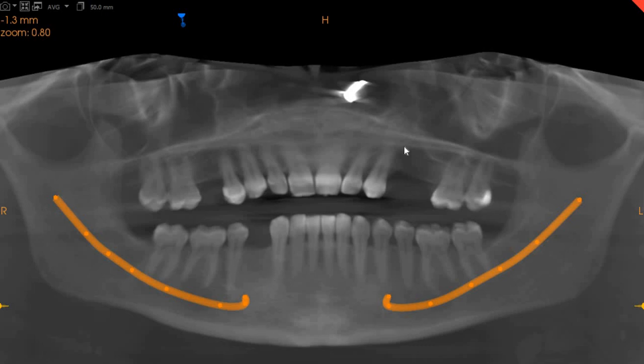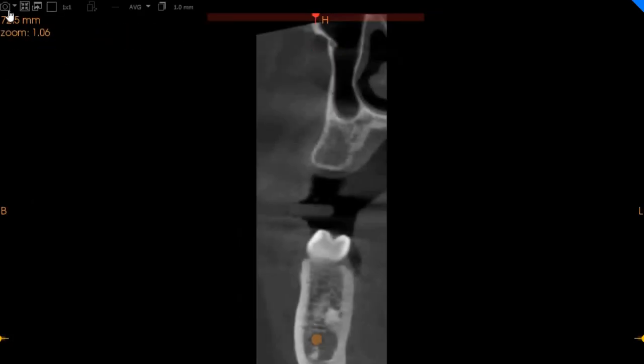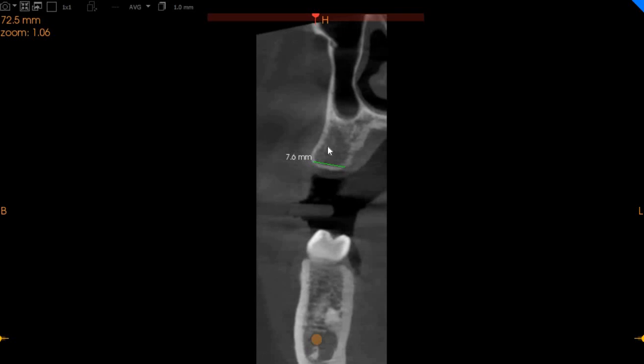Now we're going to take you to the transaxial view to give you the bone quality. The bone quality in this region is D3, because we have seven millimeters of width with eleven millimeters of height.